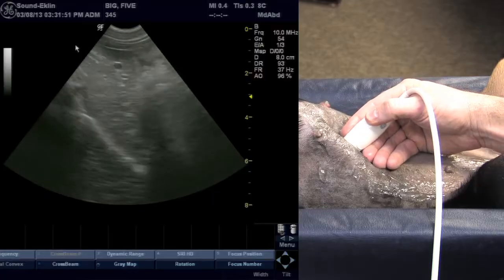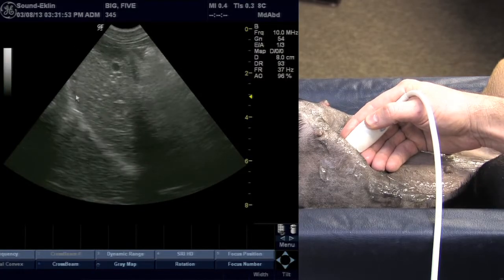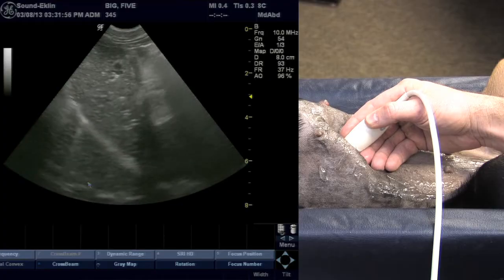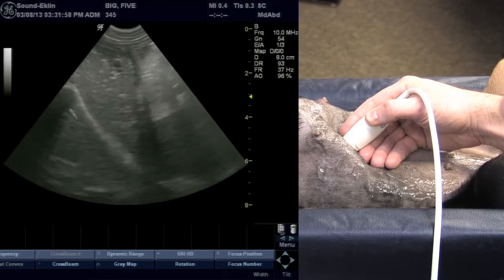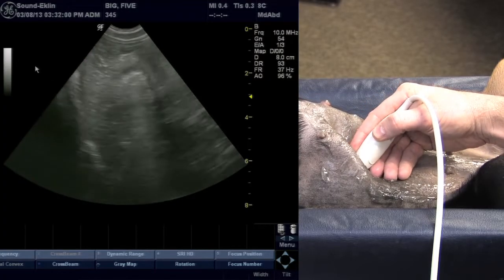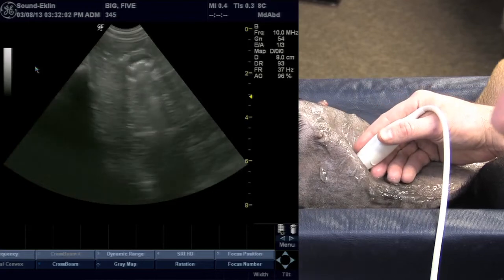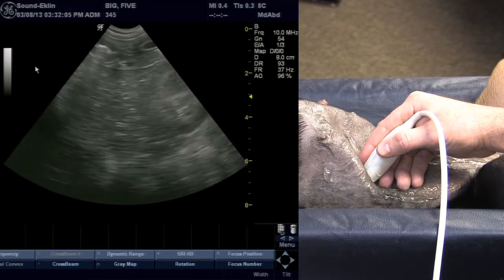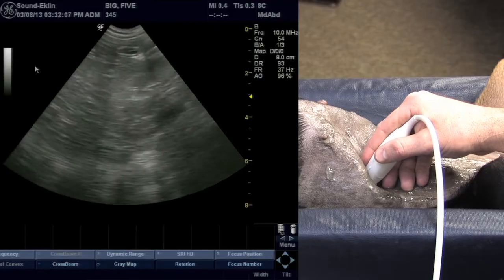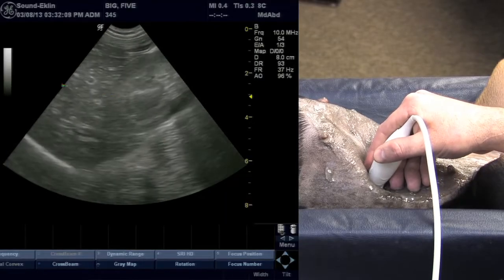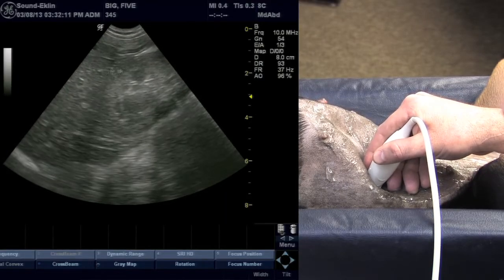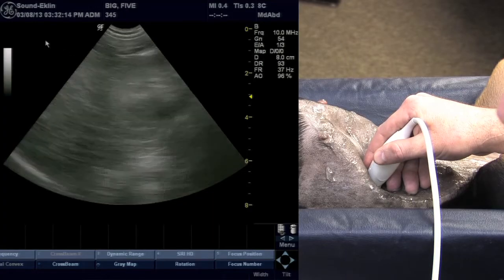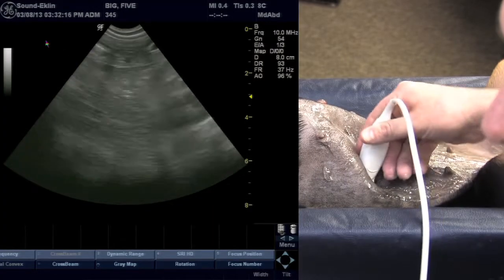We'll continue following that liver. This is the outline of where the lung and diaphragm come together. This down here is what we call a mirror image artifact. We'll continue to scan along the right thoracic wall — my stopping point on the right side is typically when I get down to the area where I can pick up the kidney and the liver. We see where that kidney is in the renal fossa, and we'll come back and talk about that when we get to the kidneys.